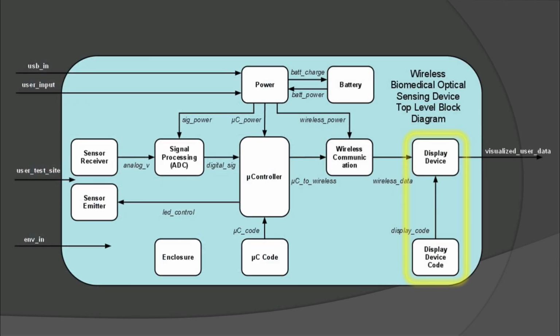To display the data, a GUI will be implemented on an Android phone using Java. A button will allow the user to toggle between displaying their blood oxygenation and heart rate readings. On each screen, there will be 3 main pieces of data displayed. The first will be the most recent measurement taken, allowing the user to see their current level of oxygenation or heart rate. The second will be the average value of the measurements taken over the last day, which will provide a more consistent value for the entire day, accounting for any outliers that may have occurred.